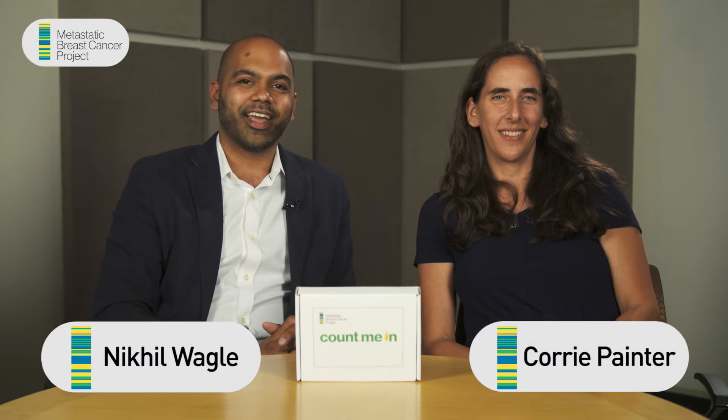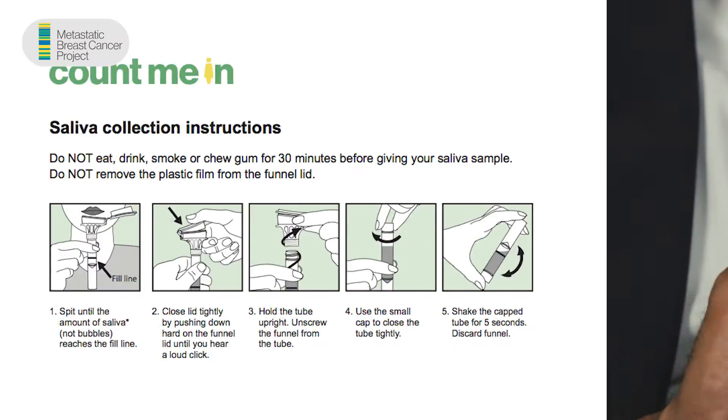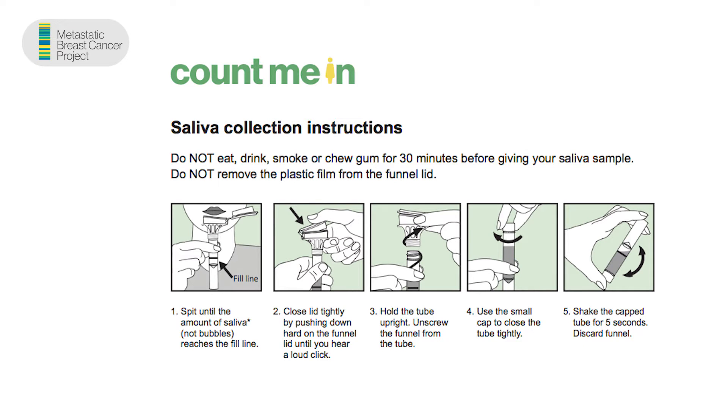Hi, I'm Cory and I'm Nick, and this is a short video to tell you how to submit your saliva kit for the metastatic breast cancer project. Let's take a look at this box — you can see it says 'Metastatic Breast Cancer Project, Count Me In.' The first thing you're going to see is a set of instructions.